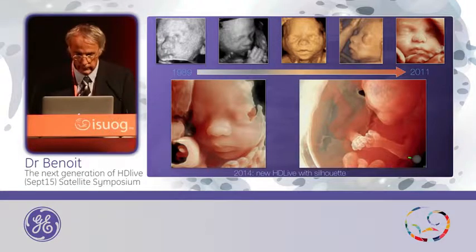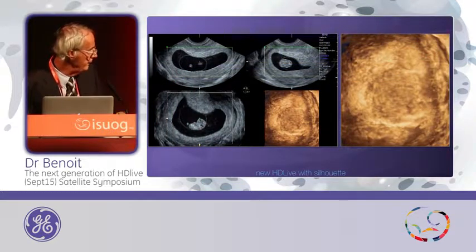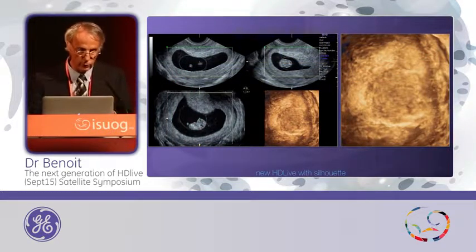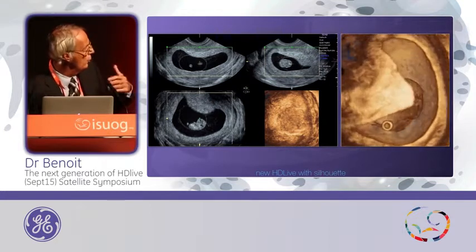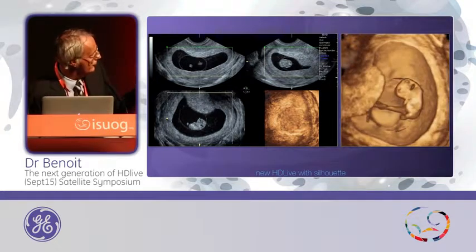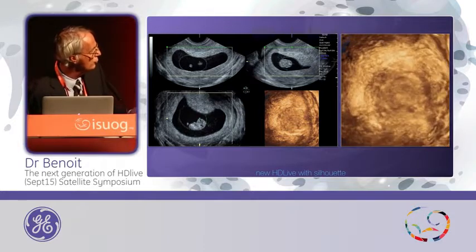on early pregnancy with the gestational sac. This is the gestational sac, so with the embryo inside, you put the box around the gestational sac. And this is how to do. When you move inside, this is a classic surface rendering. It's quite difficult. Sometimes you have to use a magic cut.